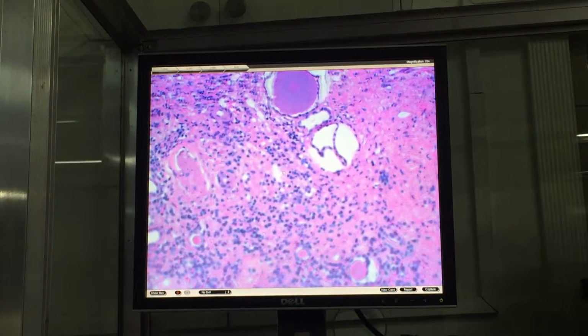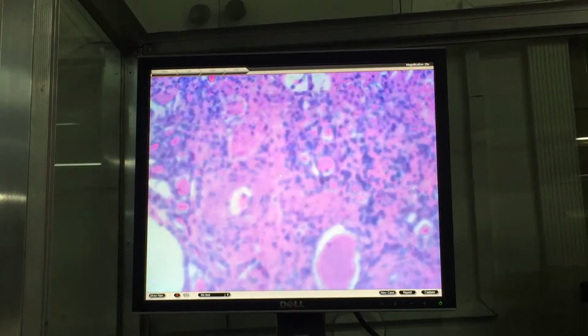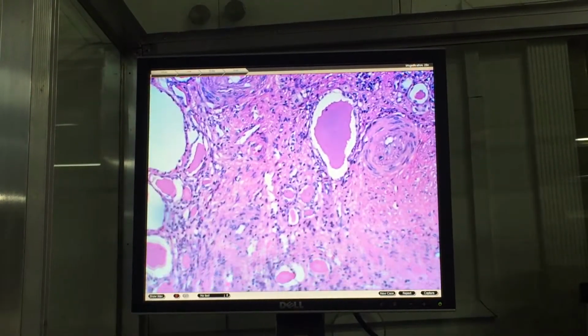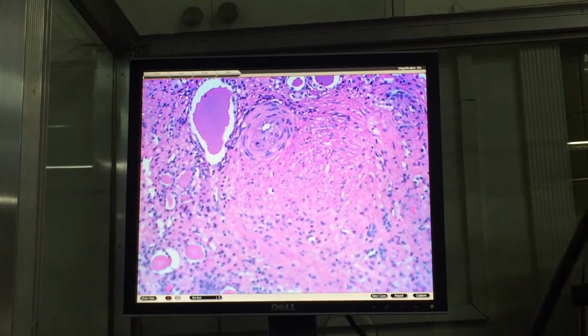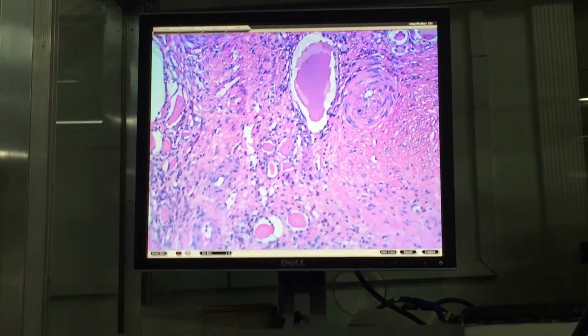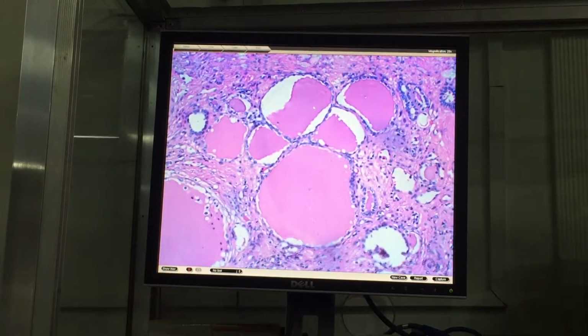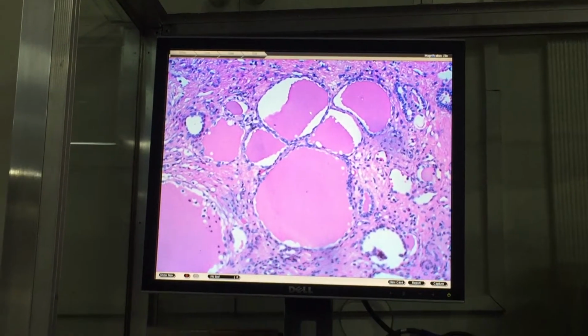Similar to your diabetic nephropathy, you will see sclerosed glomerulus, okay, and prominent, of course, your prominent thyroidization of your tubules. Don't mistake that for the thyroid, okay?